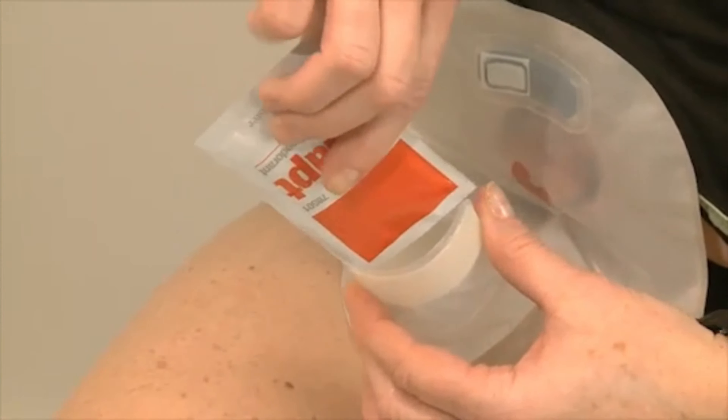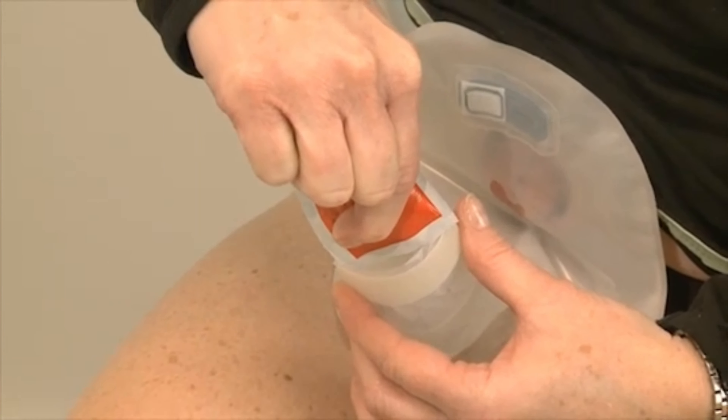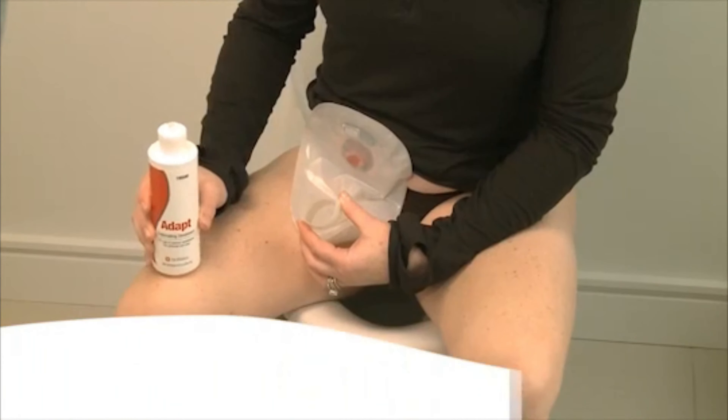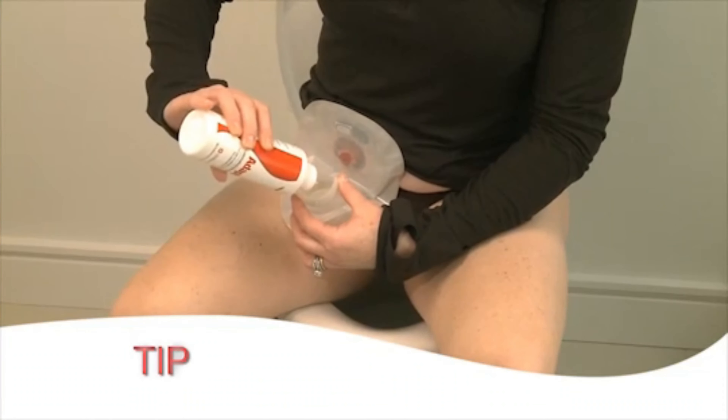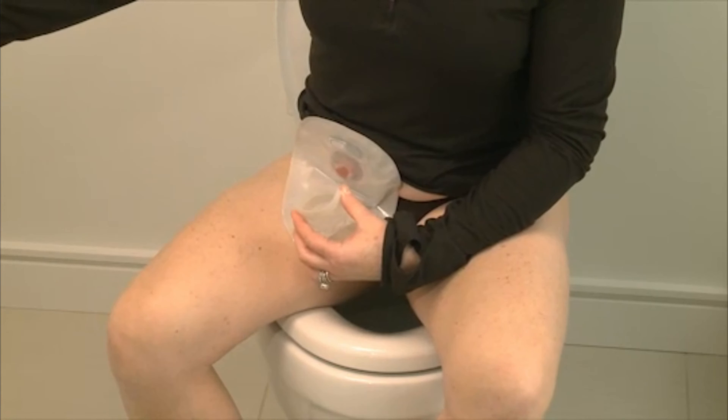If you are using a packet of Adapt Lubricating Deodorant, empty the entire contents of one packet into your pouch. You will need to use Adapt Lubricating Deodorant each time you empty or change your pouch, not just the first time.